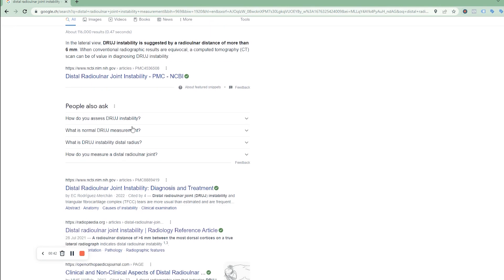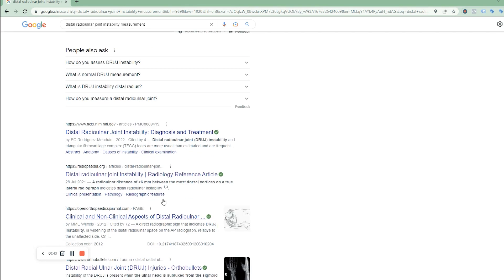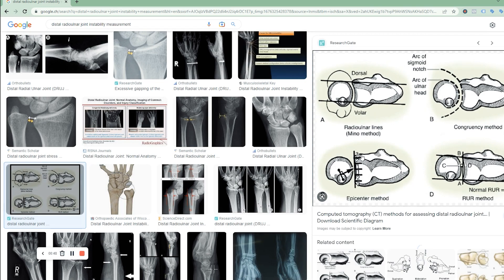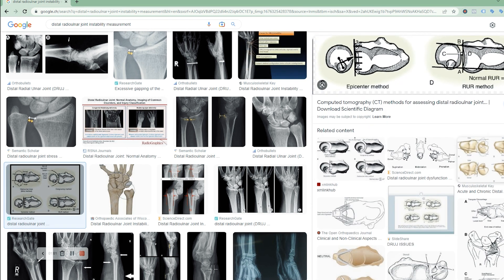You either go through articles or look at images, and very quickly an illustration jumps up showing these different methods: the Mino method, congruency method, epicenter method, and RUR method. It's kind of like a scheme — it's always the same thing.